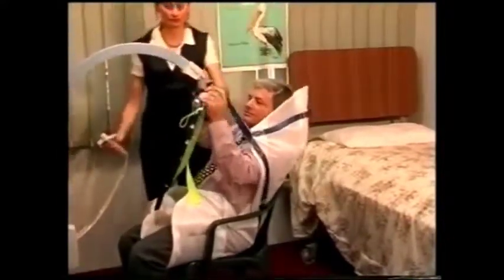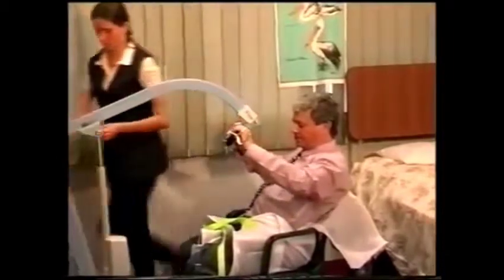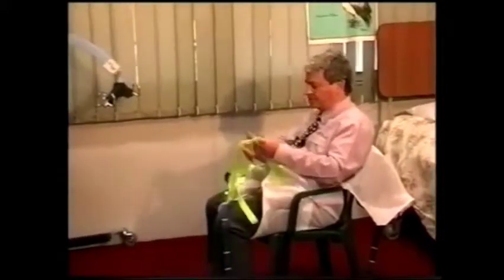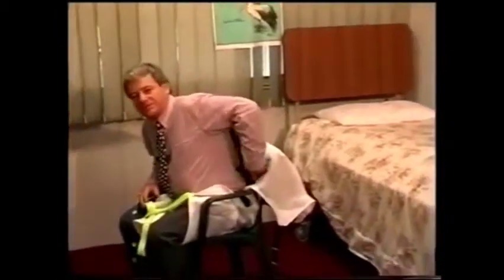And now we've got another effort. One thing that happened the other day, we had someone who really wanted the patient to be quite horizontal as they pick them up, so they used a shorter leg strap on there and they put a pillow in. Where's the pillow gone, Vicky? We could see you crawling across under there. Yeah. And we put this pillow in the back here, just like that, and then the sling went in. And that meant that their back wasn't bowing. I found it very comfortable when I was experimenting with it. So it's something to think about when you're having to move a patient who may need that extra support when they're lying more horizontally. Right, if we can come out of this one and we'll show another type of sling.